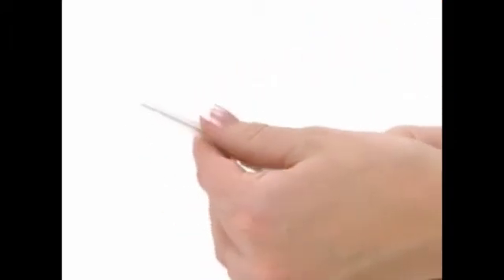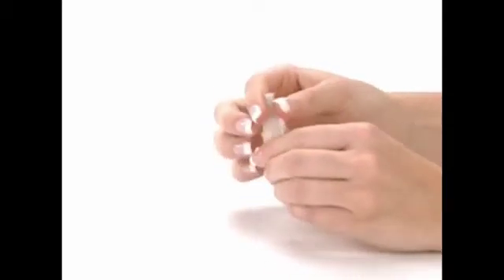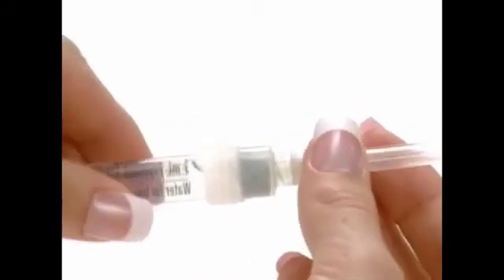Recap the syringe needle. Detach the mixing needle from the syringe and lay down the syringe. Remove the wrapping from the gray injection needle. Twist the injection needle on the syringe and remove the cover of the needle.